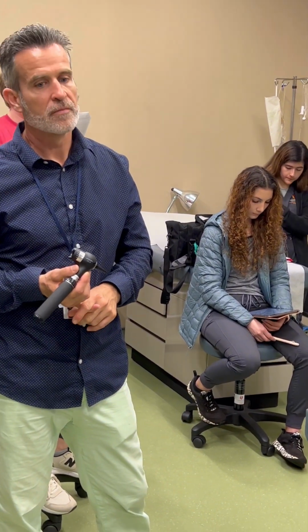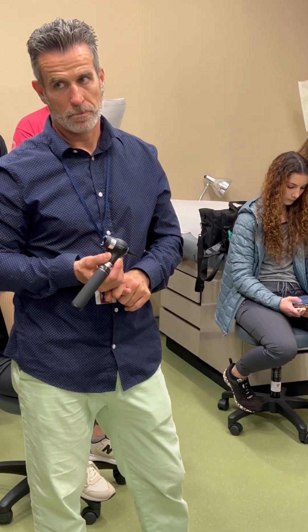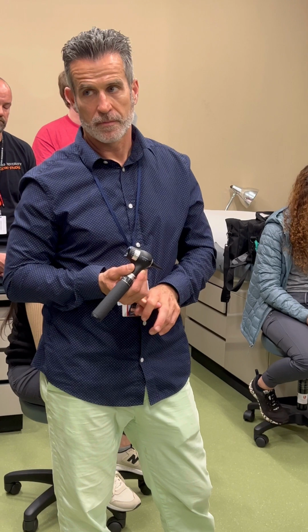Identifies the TM landmarks: malleus, umbo, pars tensa, pars flaccida, cone of light. Okay. I'm noting the color of the tympanic membrane as pearly gray.